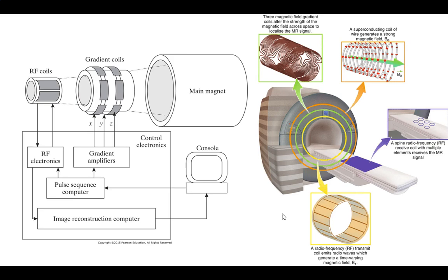as pulses and everything are going on. You don't want it heaving, you don't want it shifting, anything else. That is your North Star, so to speak. So it's got to be very, very well set. And then there are images of the gradient coils that are on. We'll take a look at them in a little more detail in a second. And then there's going to be a bunch of different coil styles. This is a birdcage style that's shown here, but we'll take a look at a few different ones.